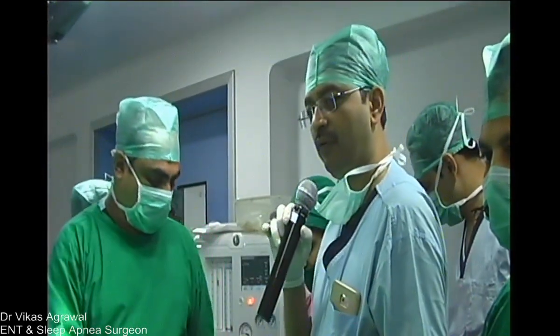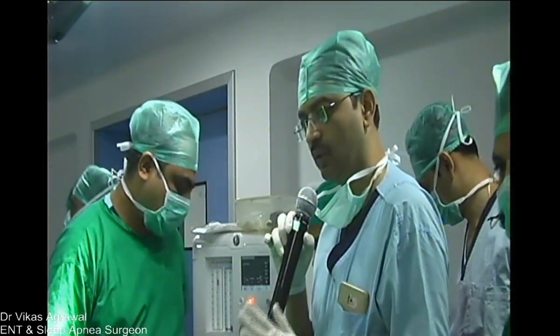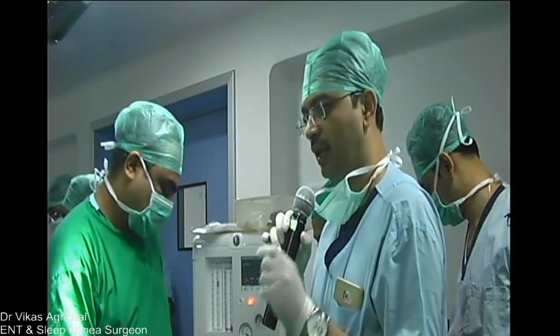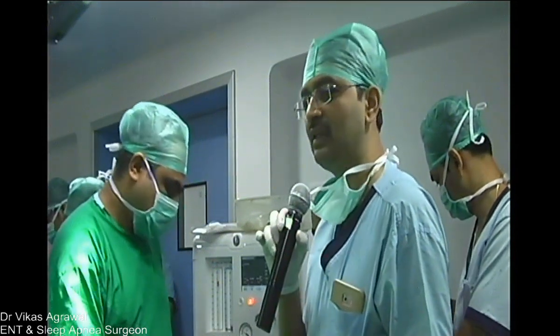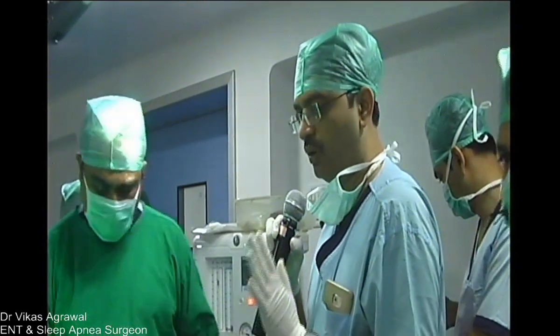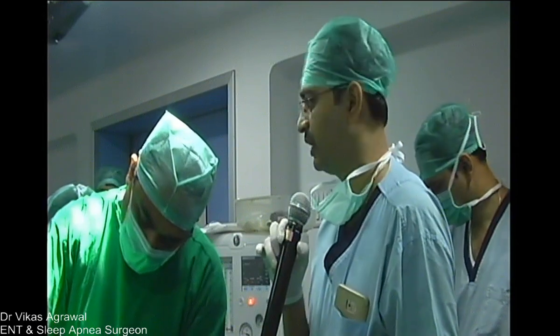I generally wait for 5 to 7 minutes before I extubate, because by that time the blood will clot, and the clotting system will act over there. If by chance there is some bleeding, which we don't want during extubation, we still have time to tackle it. So no hurry in extubation is another important point when we want to extubate this kind of patient.